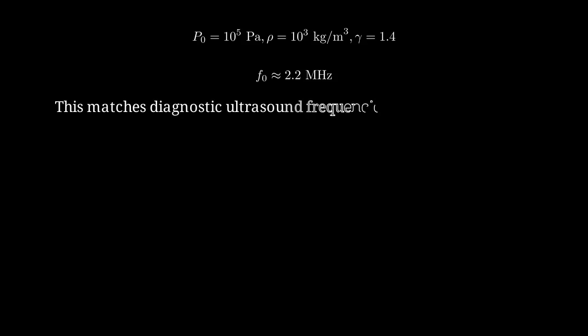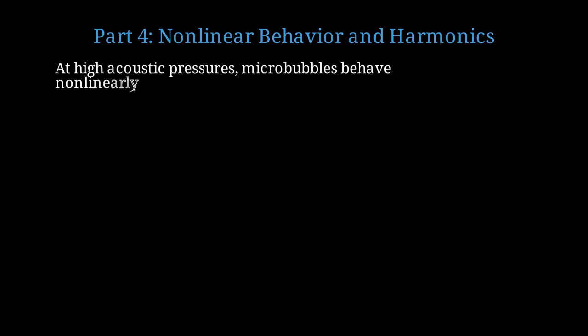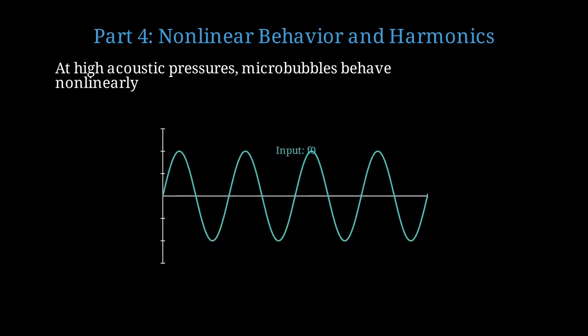This is not a coincidence. Medical ultrasound frequencies from 2 to 10 megahertz are specifically chosen to match microbubble resonances. One of the most powerful features of microbubbles is their nonlinear response to ultrasound. When driven by sufficiently strong ultrasound, microbubbles exhibit highly nonlinear oscillations. Here's the input ultrasound wave at fundamental frequency f0, which is a simple sinusoidal wave.